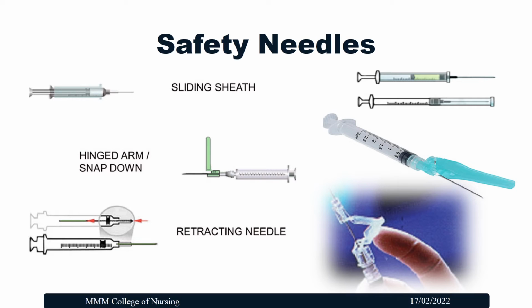Safety needles. In safety needles, there is a needle guard that is applied immediately after the injection procedure, so that it avoids the risk of needle stick injuries. These needle guards are available in different forms.